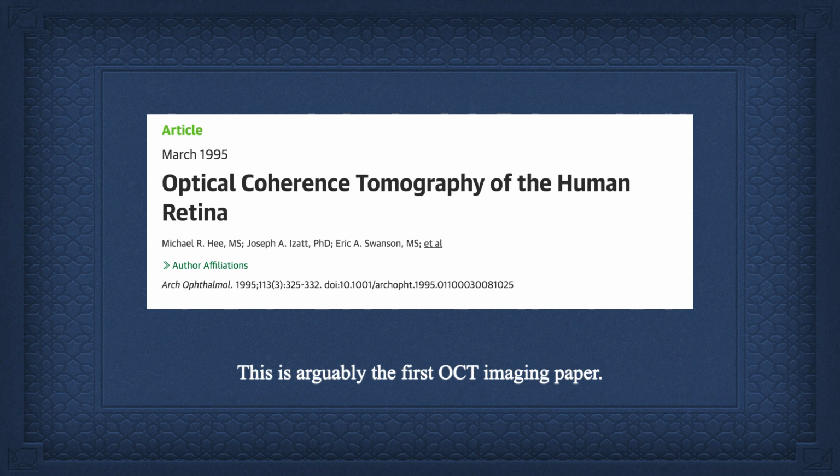It started around 1993, which was more morbidity and mortality driven. But in this particular paper, they didn't need to match on a micron scale histology with the OCT images, because the retina has well-defined layers, and you can test the hypothesis successfully without it.